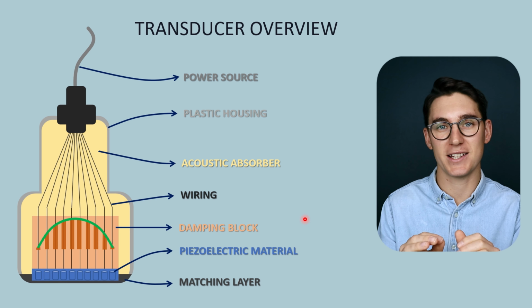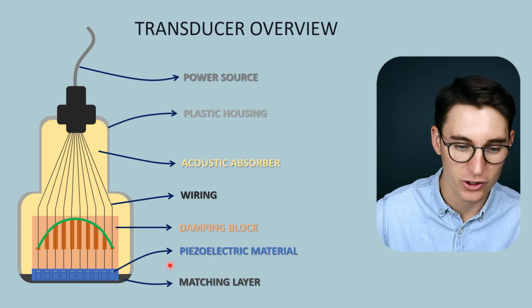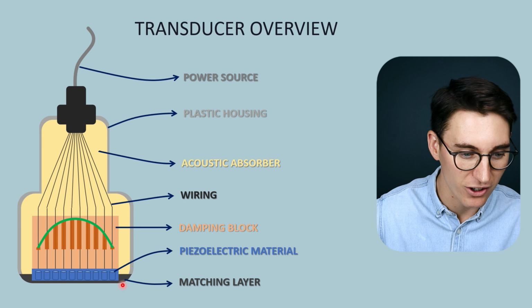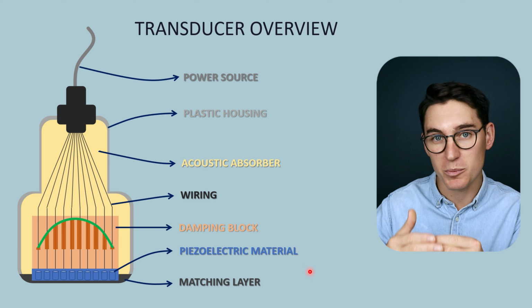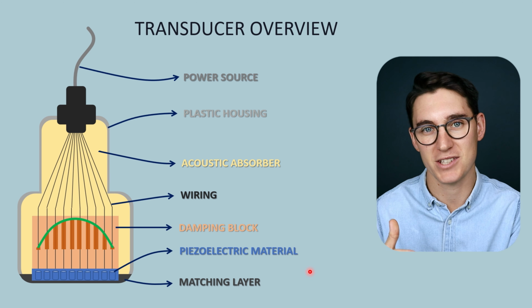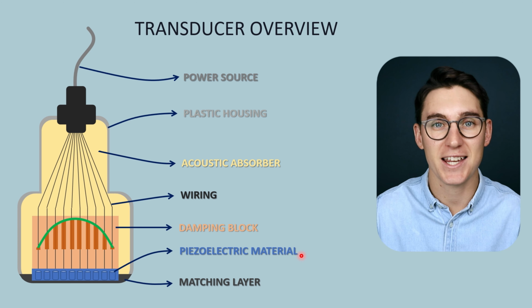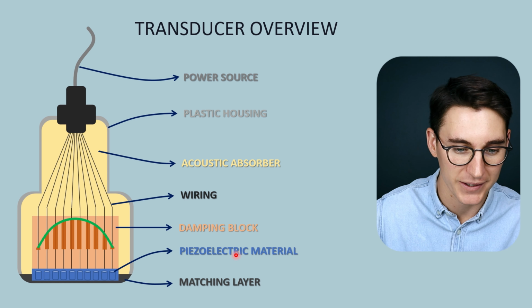Now I'm going to separate these two talks into a part 1 and a part 2. In this talk we're going to look at the piezoelectric material and the matching layer, the front layer of our ultrasound transducer, the part of the transducer that is responsible for creating ultrasound waves and propagating those waves into a tissue. In our second part we're going to look at the damping block and the wiring that is supplying this piezoelectric material.